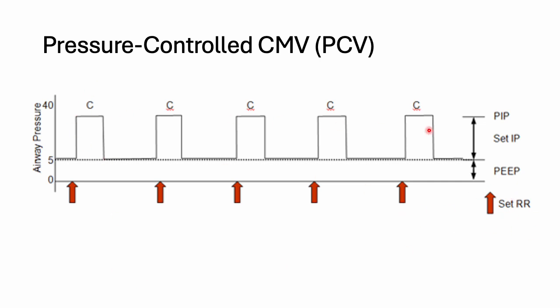Okay, this is on the assumption that for this particular graphic, the person is sedated or paralyzed, which is very similar to when you are anesthetized on an operating table, when the anesthesiologist intubated you, and then your breathing is dependent on a mechanical ventilator. Same thing. Yeah, fully anesthetized or paralyzed. Okay, and these are the so-called set respiratory rate. At the set respiratory rate, when the time comes, the machine will deliver the breath.